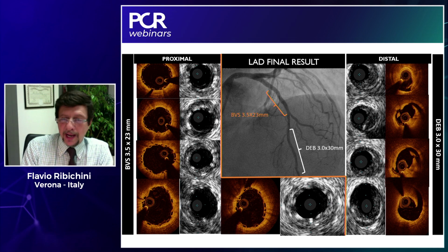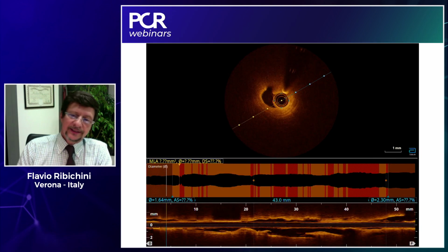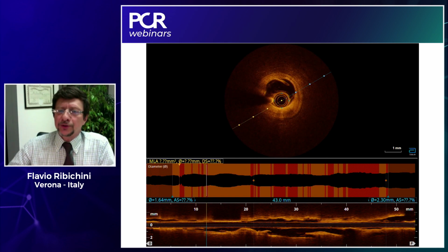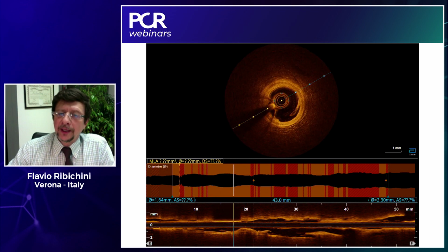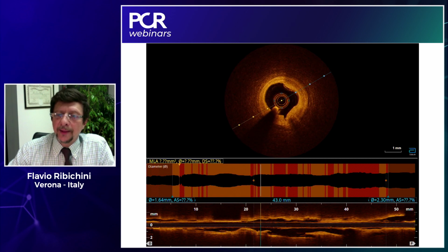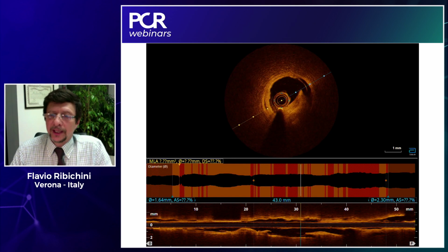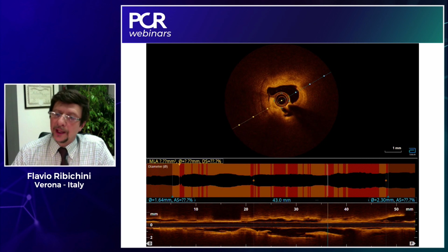Let's have a quick run through the full OCT study of this patient. You will see that the distal vessel is really very small. Indeed, the probe is almost occlusive. At a certain point, it gets better, but you start watching the dissection at time 12. From there, you see the dissection, which looks quite benign, with residual stenosis. But at a certain point where the balloon has been effective, you have this kind of intravascular imaging, which is, of course, very different to what you have seen with your angiogram.